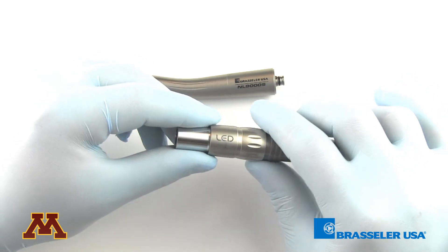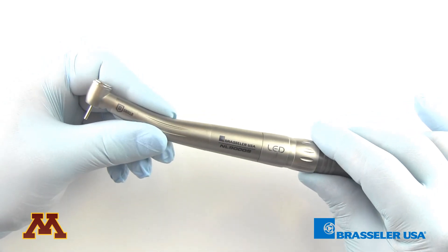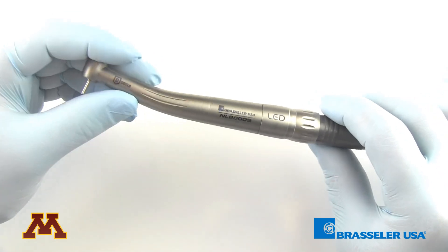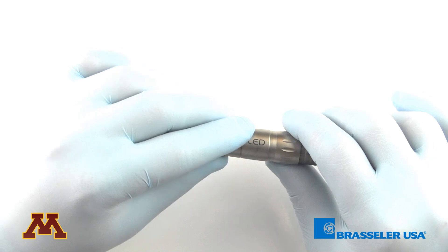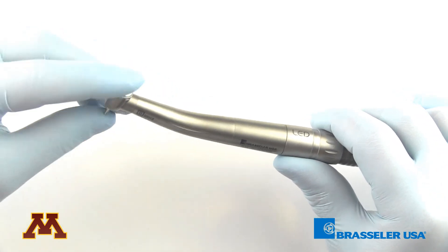Do not attempt to remove it. The high speed hand piece is a very simple connection — you just push down and the high speed locks into place. One thing that's nice about this setup is it's a quick disconnect, but it also allows for a swivel.